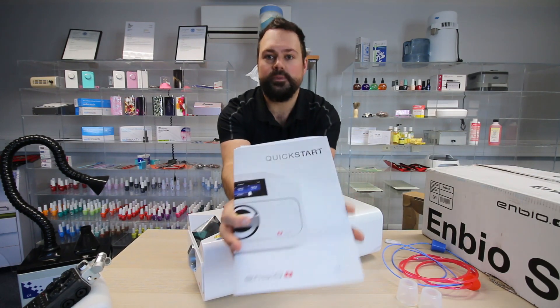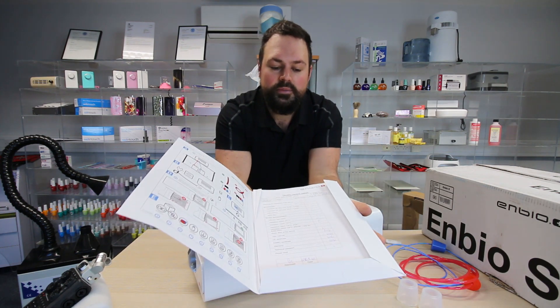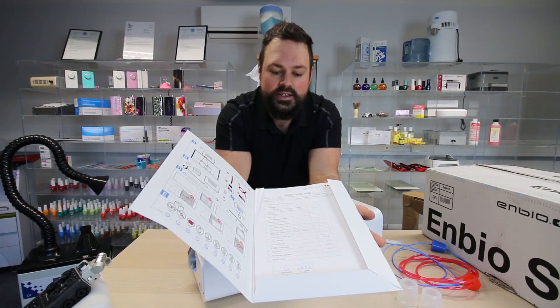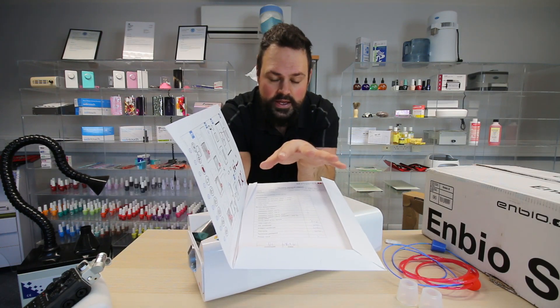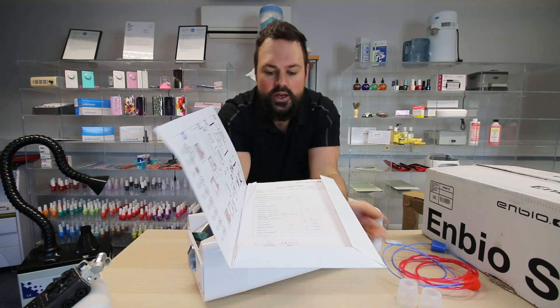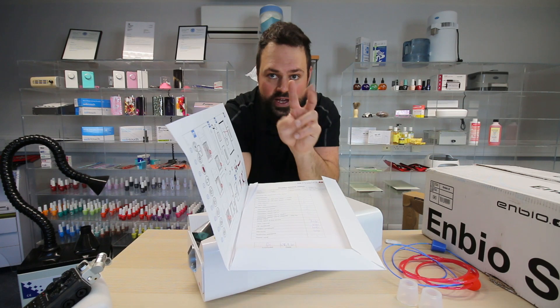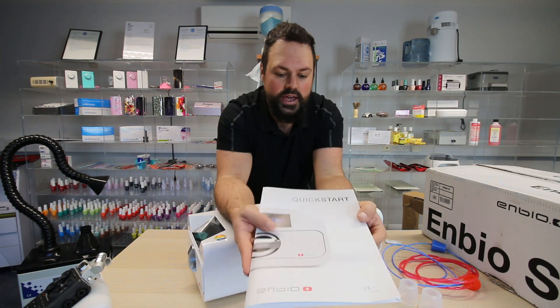Inside the box, you'll get a quick-start guide with all your validation certificates inside. This is a self-validation machine. It means that when it comes out of the factory, it's tested. And this paperwork, to prove that, comes to us as a distributor. We test it, and then it eventually goes out to customers. So all you need to do is run two tests on the machine, which I'll touch on later, and then you're good to go. You get a quick-start guide.